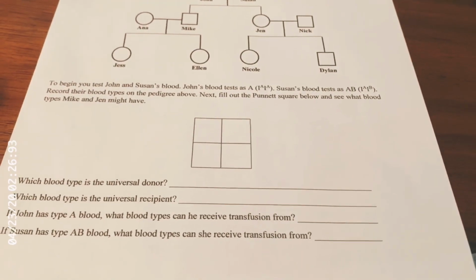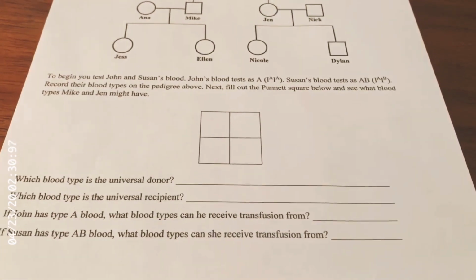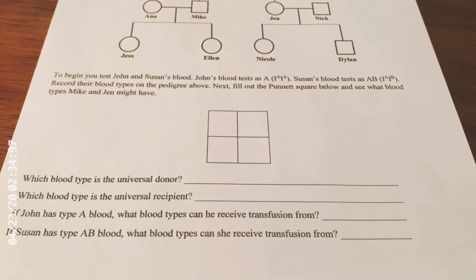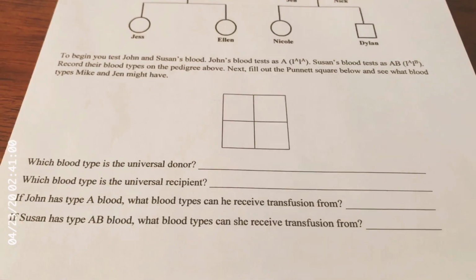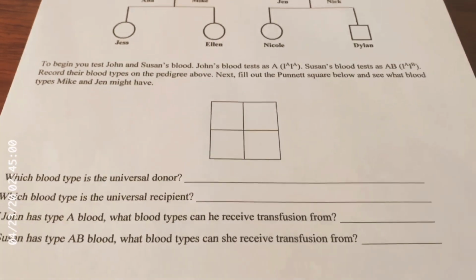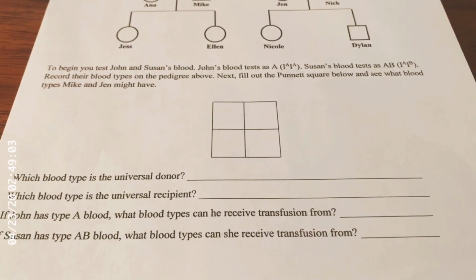All right, so obviously the first thing you need to know before going into this lab is what type of blood John and Susan both have. So to begin, you test John and Susan's blood. John's blood tests as A. He is IAIA. He's homozygous for A. Susan's blood tests as AB. IAIB. Remember, blood typing is co-dominant. Record your blood types on the pedigree above.